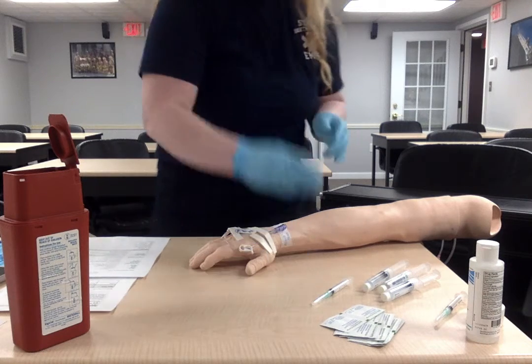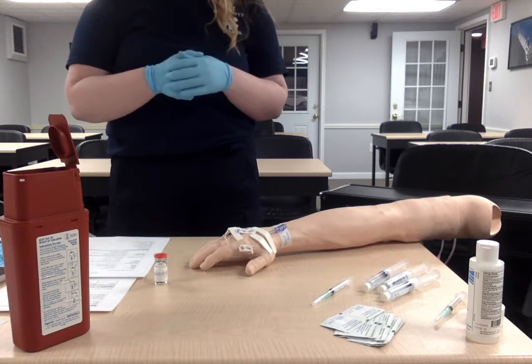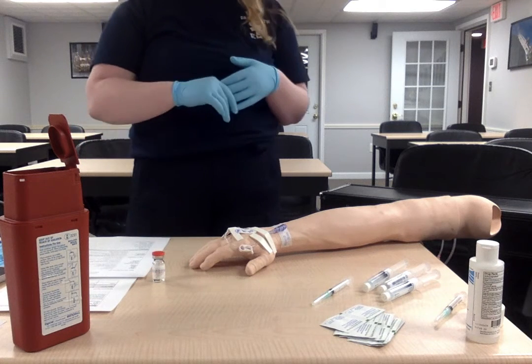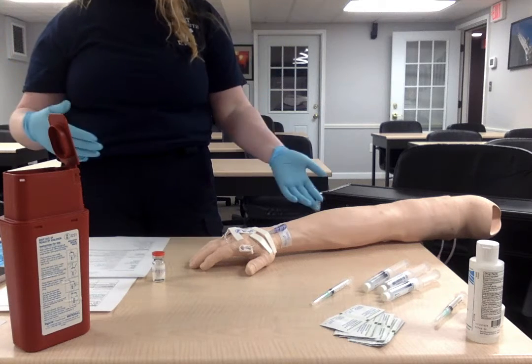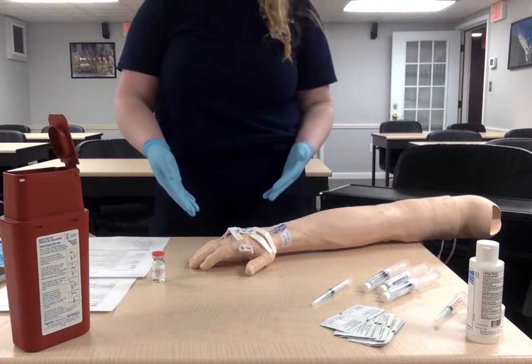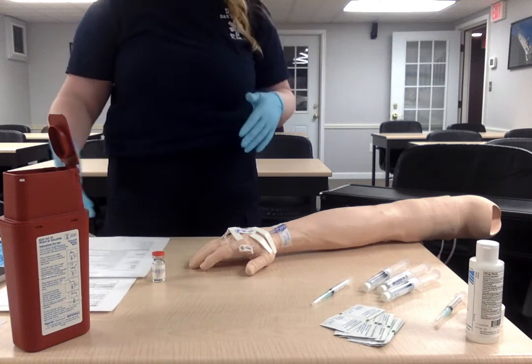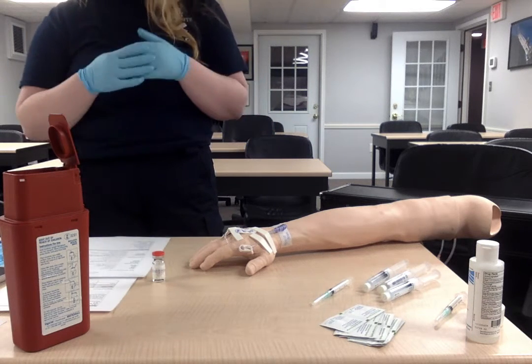So now we have our drug, which is bumetanide. We want to make sure it's the right drug. We want to make sure it's the right dose, so it's 0.5 milligrams that we are supposed to be giving. This comes 0.25 milligrams per ml, so we'll be giving 2 mLs of this medication. At this point, it's the right time, so we know what time it is. Right route is the IV push, so we already have an IV established, so we'll give it through that. We also want to make sure it's the right patient, which we confirmed via ID band, as well as with the patient and patient order that this is Mary Edwards. And we're also going to make sure that we do the right documentation as well.